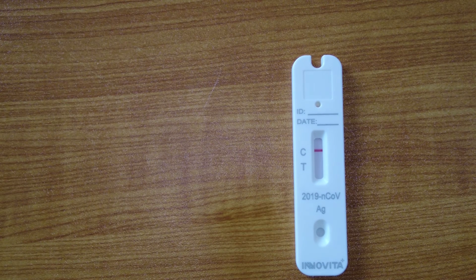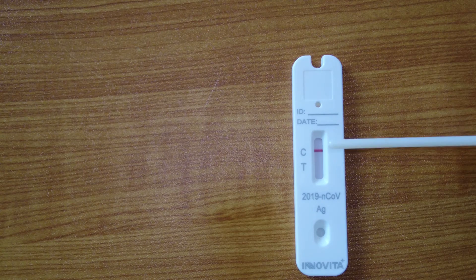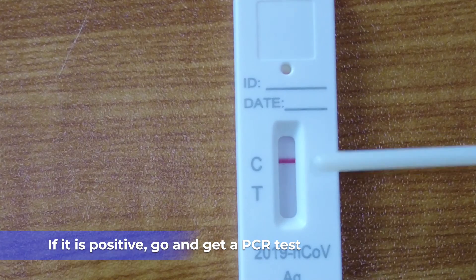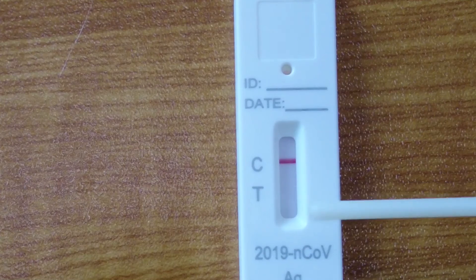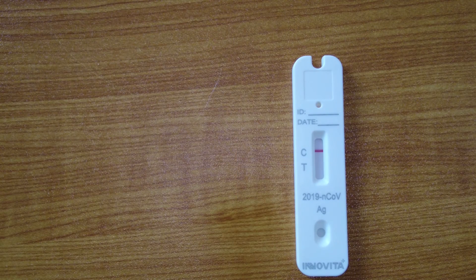And that is it. The test is over. Today my test is negative. You can see the line across from the C. If the test is positive, there would be a line across from both the C and the T. Any other results and you will have to retest.